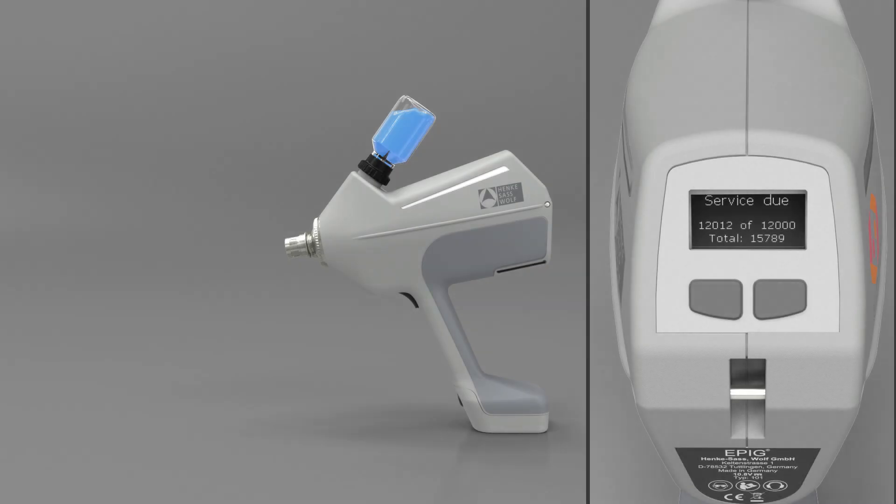Service of the EPIG is required after every 12,000 injections. When service is due, the message Service Due will appear on the display. All wear and tear parts are combined in one unit, the cylinder.